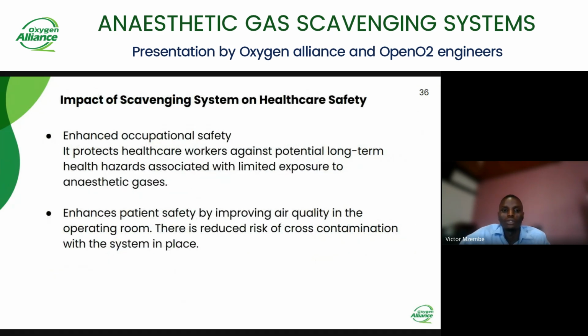For the last part of the presentation, we'll look at the impact of the scavenging system on healthcare safety. The first thing is that with the scavenging system in place, there's enhanced occupational safety. It protects the healthcare workers against potential long-term health hazards associated with exposure to waste anesthetic gases.